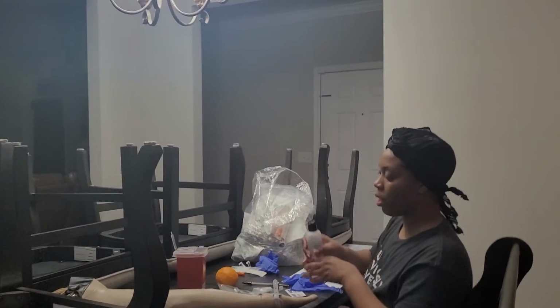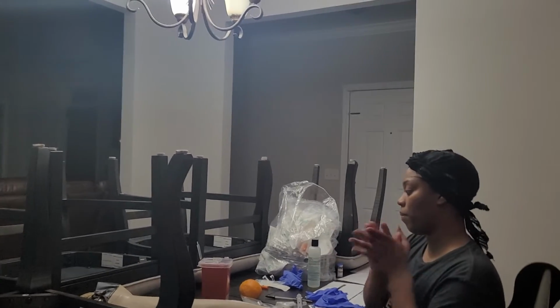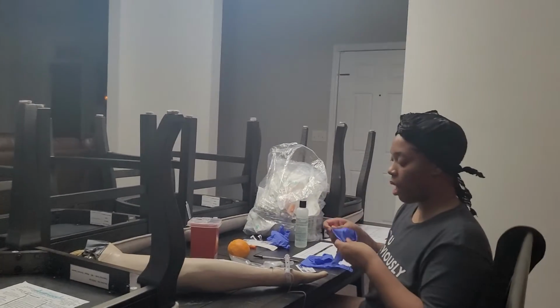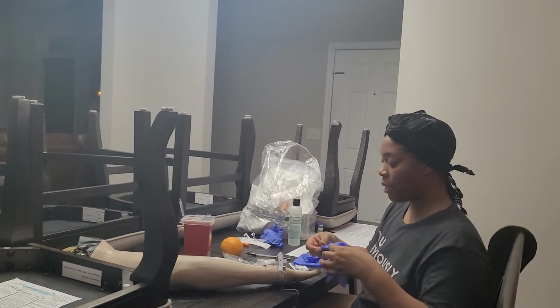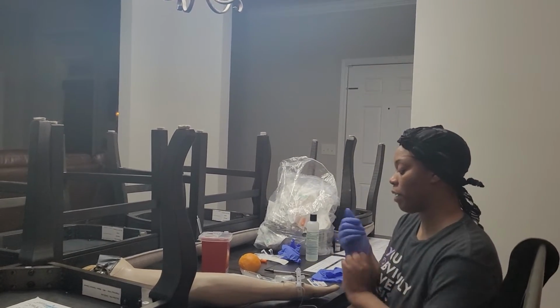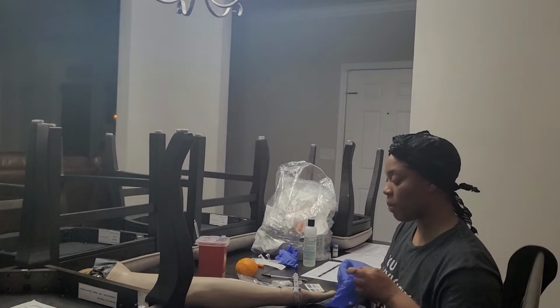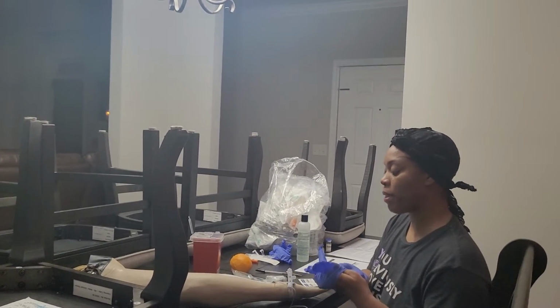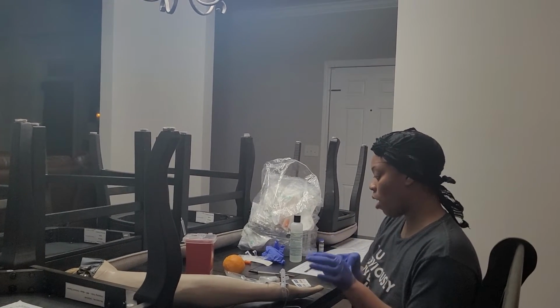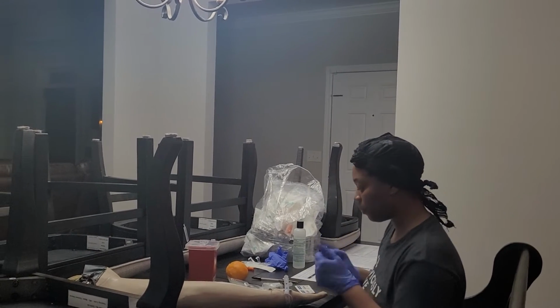All right, and I am going to go ahead and just perform my hand hygiene one more time. Don my gloves again, and I'm just letting Miss Larson know that I'm about to administer her IV push furosemide, which is a diuretic. So it might make you go to the bathroom a little bit more. We make sure we put the bedside commode nearby once we are all done, just so that we don't have any falls.